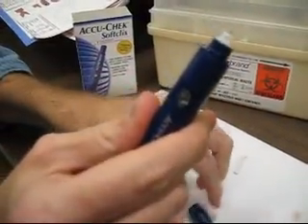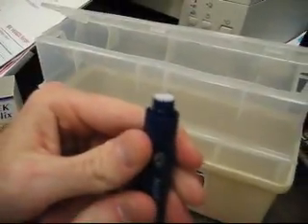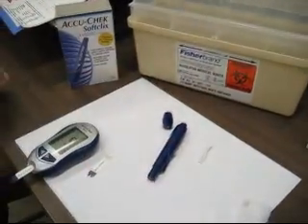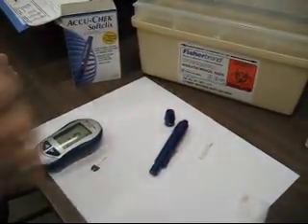Make sure to eject the used lancet out of the device by pushing on the midsection away from you into the sharps container. The next person is ready to use the lancet device.